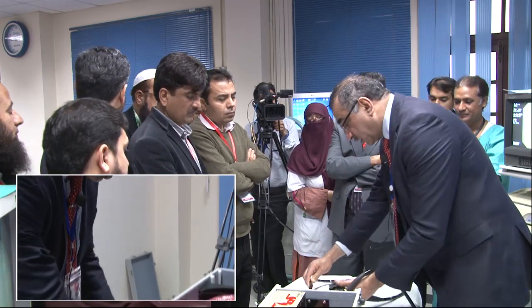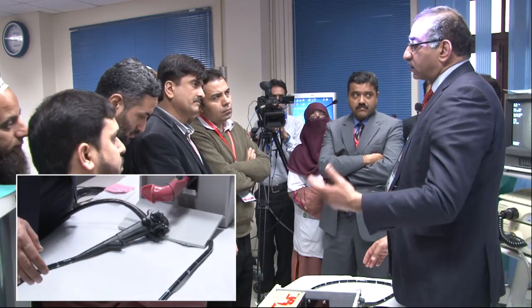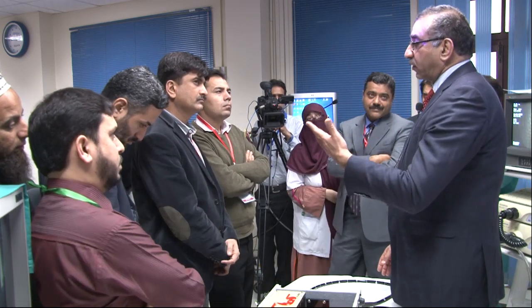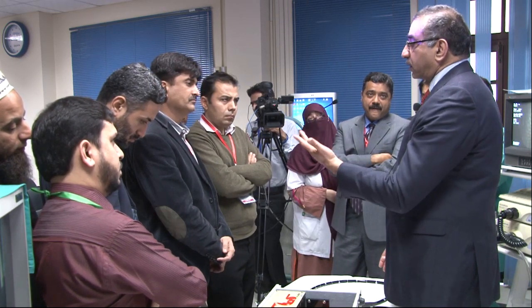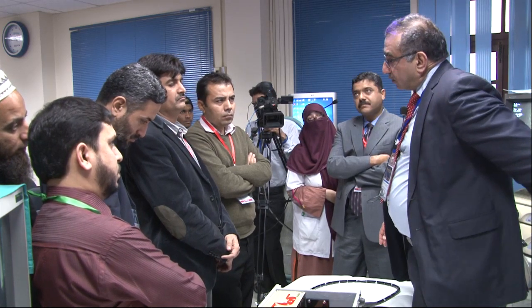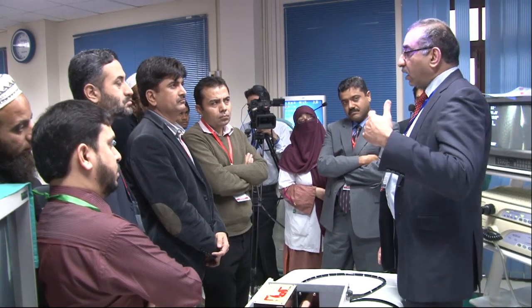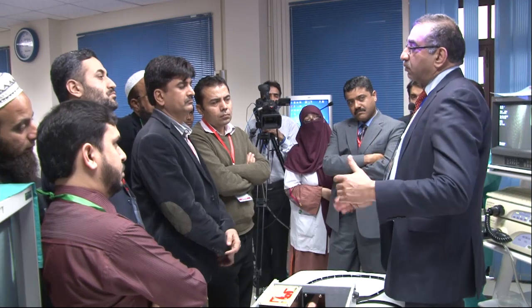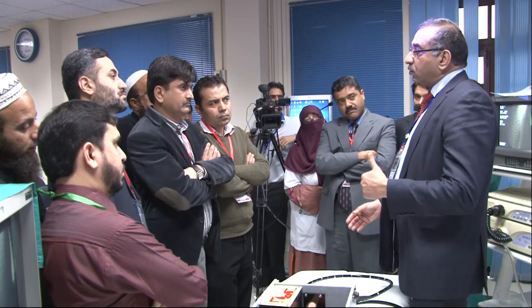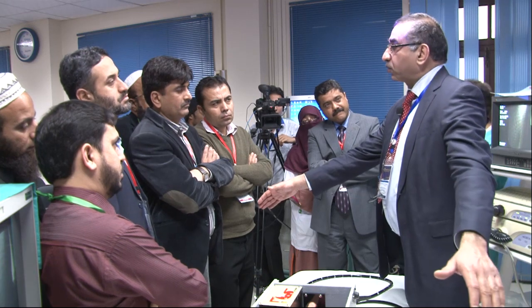Position of the patient for ERCP should always be such that the patient is safe, the approach is good for you, and the final position of the papilla is optimal. The best position is arm behind the back and the patient lying semi-prone, right? When you are intubating the patient, we keep them side up a bit more, in the semi-prone position. When you get into the duodenum, you can lie them almost completely prone.